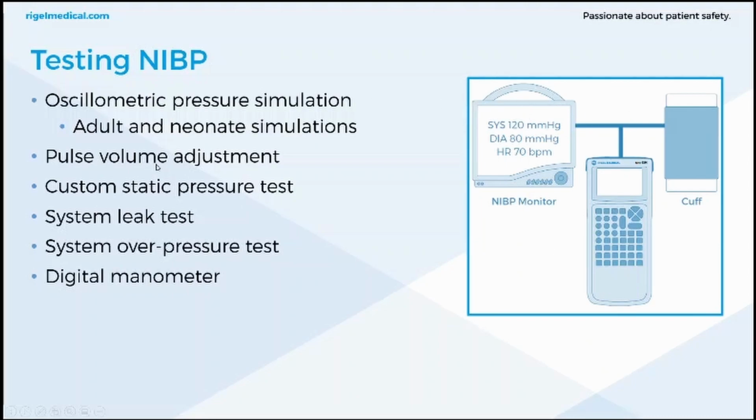There's pulse volume adjustment and custom static pressure tests. It's important to note, because we get the question a lot, that static pressures are useful for verifying the performance of the pressure transducer and verifying the integrity of the tubing, whether there are any leaks, but also the accuracy over a range of pressures.